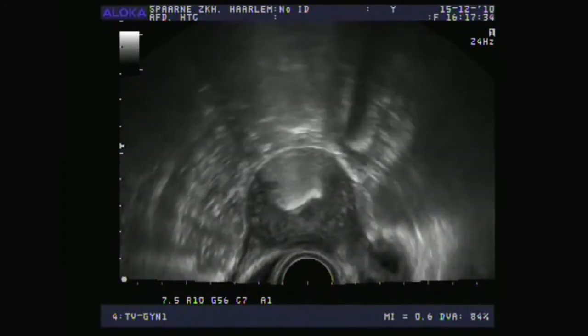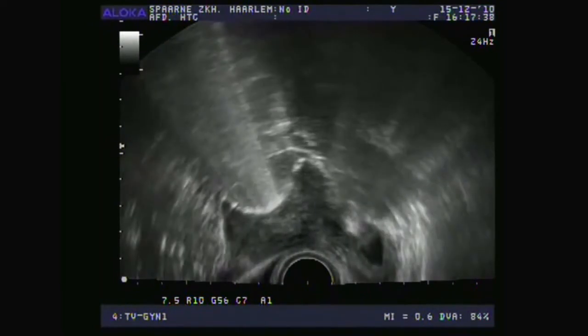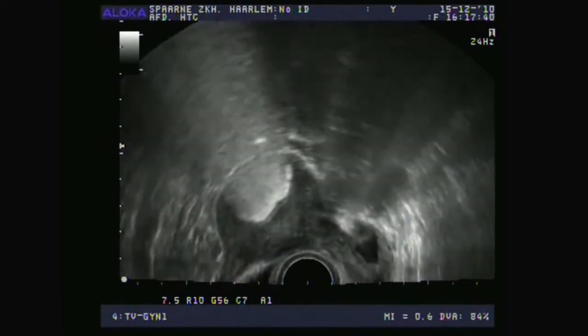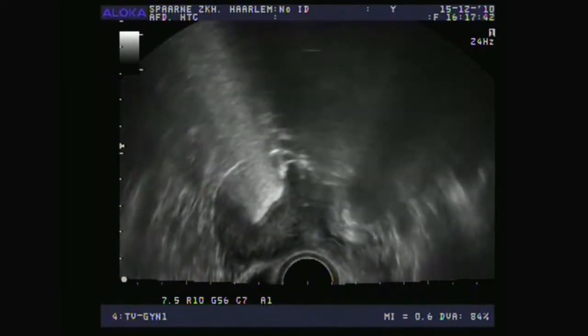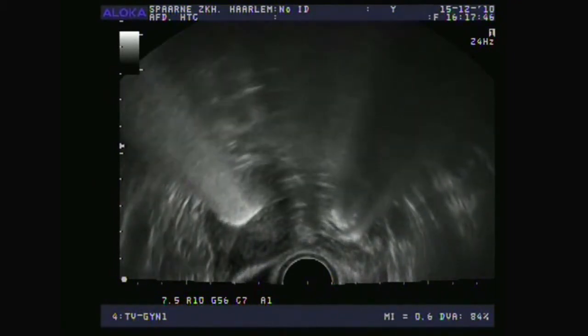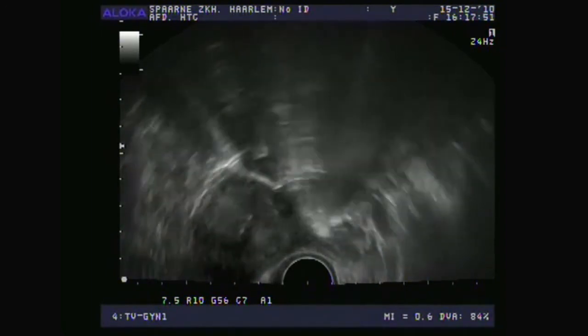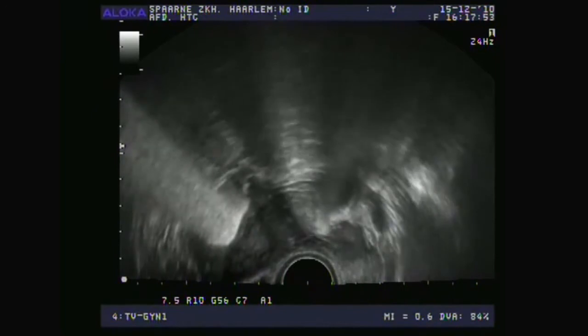Even if this doesn't happen, and you can only see a nice, thin, slender fallopian tube, it still means that it's open. After all, a blocked fallopian tube could never produce such a very nice, thin, slender reflection. On this side, this fallopian tube cannot be viewed so well as it winds a lot, but you can see clearly that the foam is appearing next to the ovary.